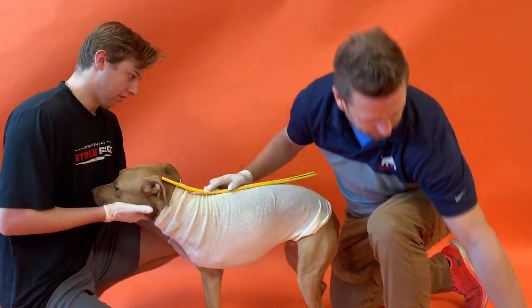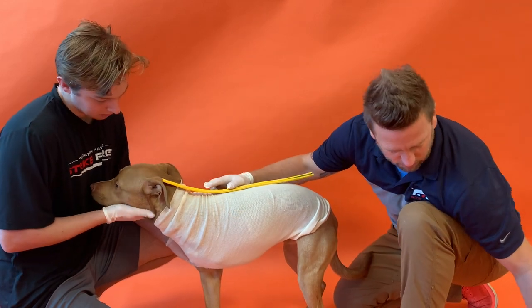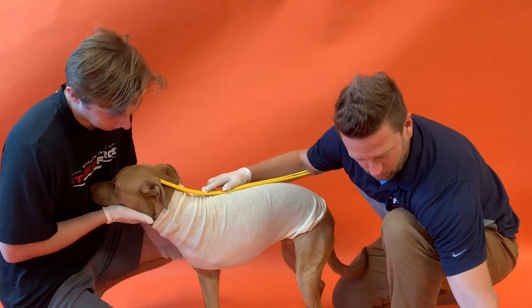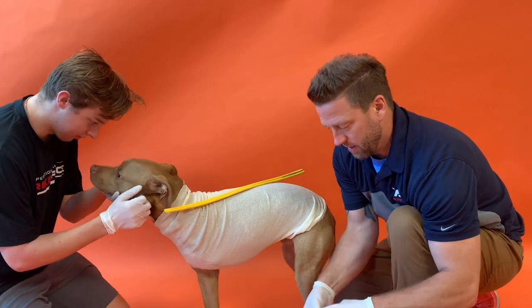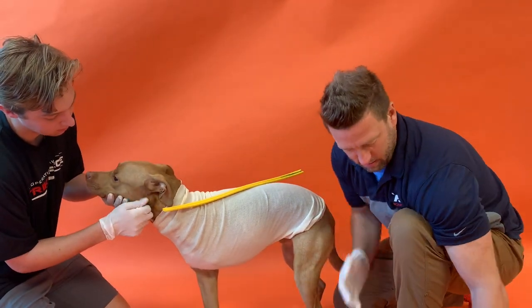Make sure to place your cut strips over the spine of the animal. Get all your casting rolls and your water bowl for dipping ready, then start wrapping circumferentially around the entire torso.